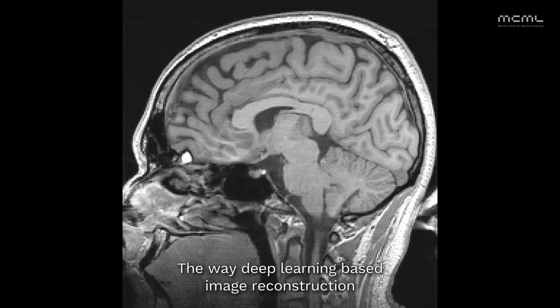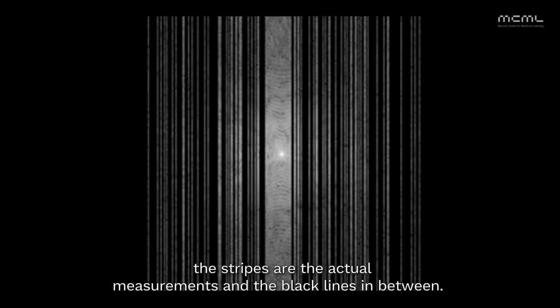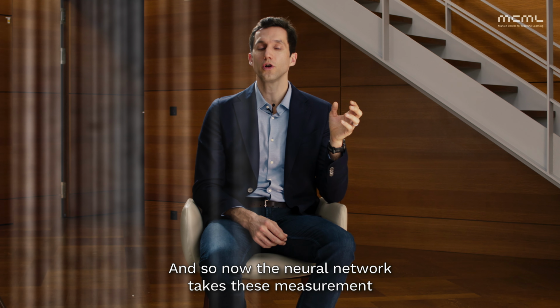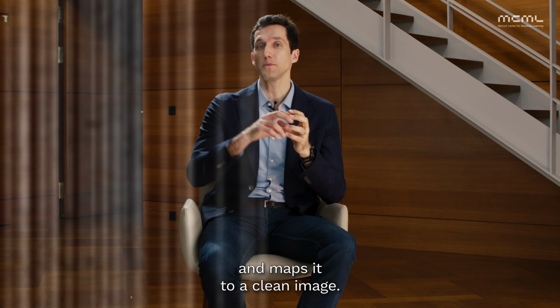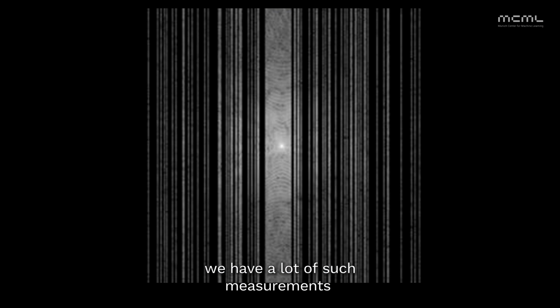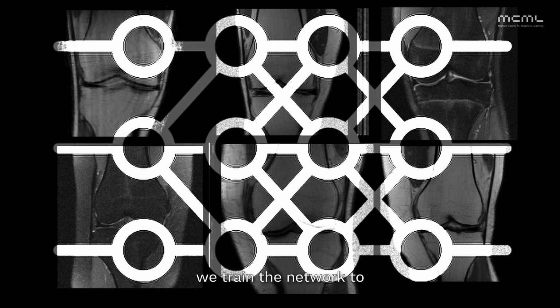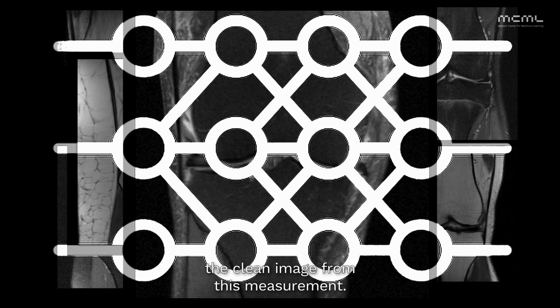The way deep learning-based image reconstruction often works is you start from the measurement. The stripes are the actual measurements, and the black lines in between, so the black stripes, are actually data that is missing. And so now the neural network takes these measurements and maps it to a clean image. And the way we train these networks is we have a lot of such measurements and corresponding clean images, and then we train the network to reconstruct the clean image from this measurement.